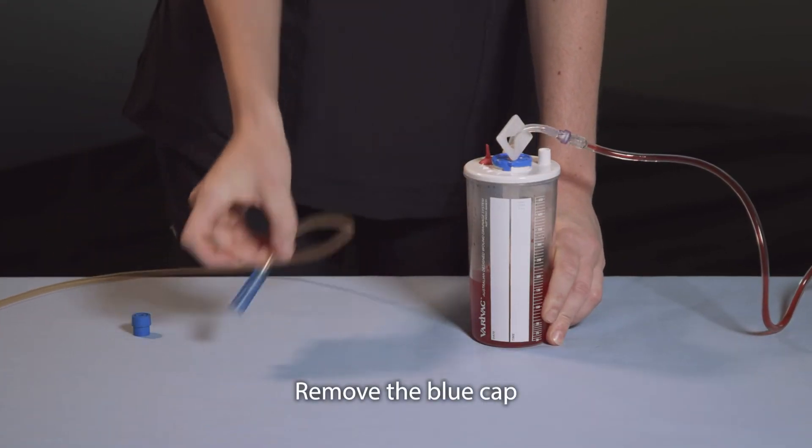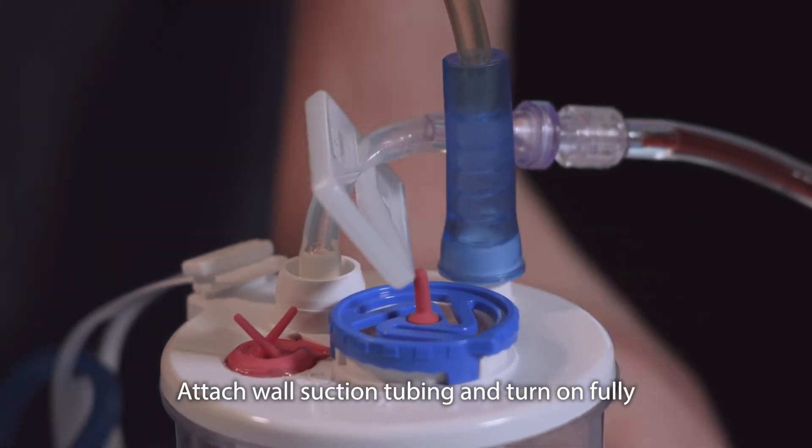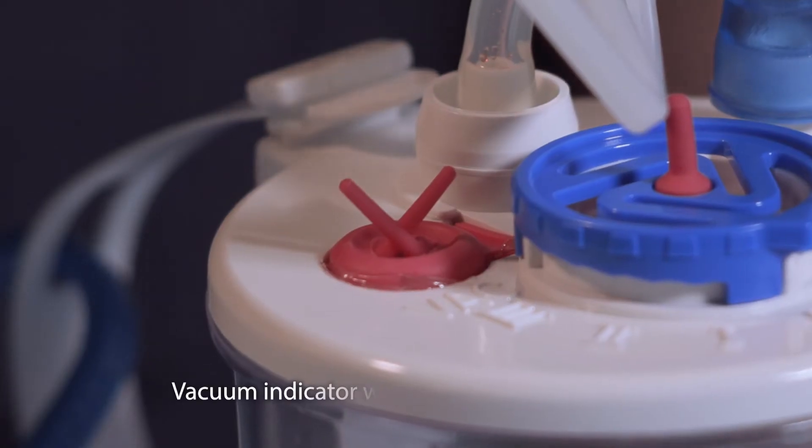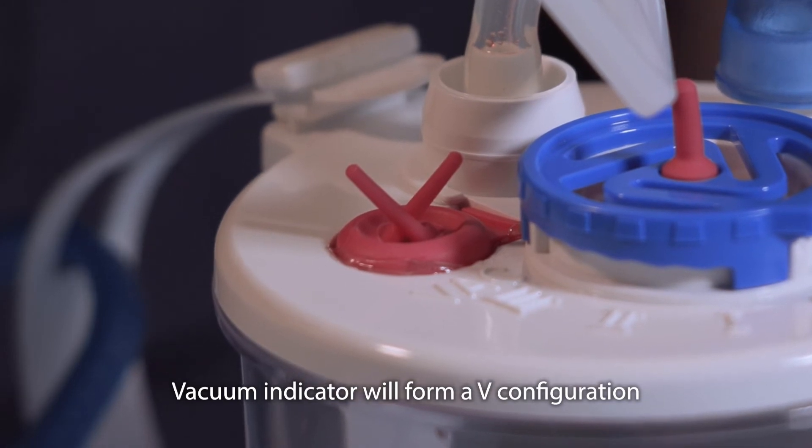Place the wall suction on this port, turning wall suction on fully for a period of 5 to 10 seconds. You will notice the vacuum indicator on top of the canister will move into a sharp V configuration as it is sucked down into the canister.